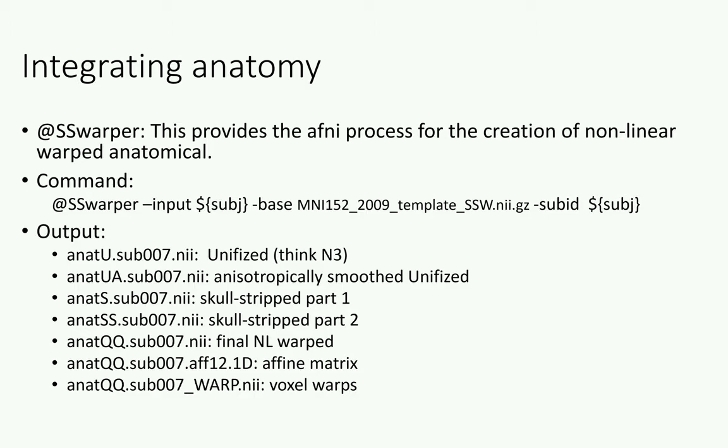I want to touch here on one of the earlier steps of our sequence, which is the tailrach. The large part of the pre-processing is taking care of spatial concerns. The large part is also taking care of temporal concerns. The temporal concerns will be taken care of through volume registration, dspike, and tshift. The spatial concerns, moving your data into universal coordinates like MNI coordinates, will be done through Talairach. It'll be done through alignment and volume registration.